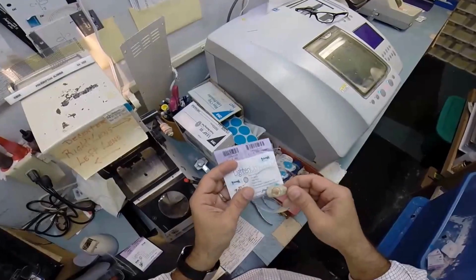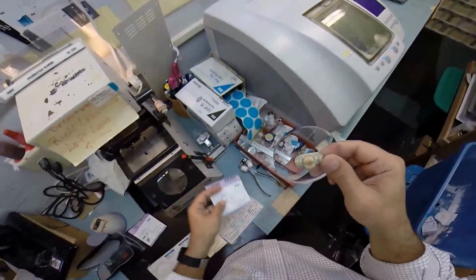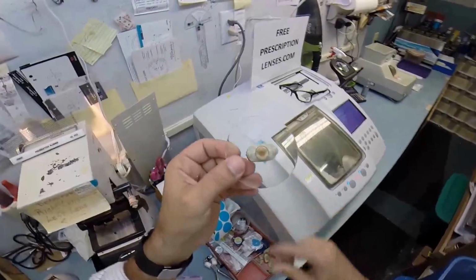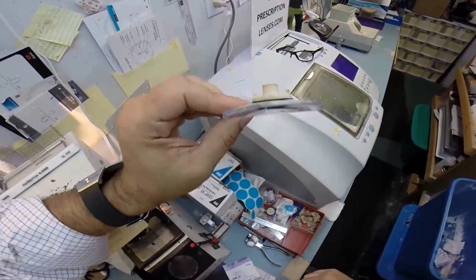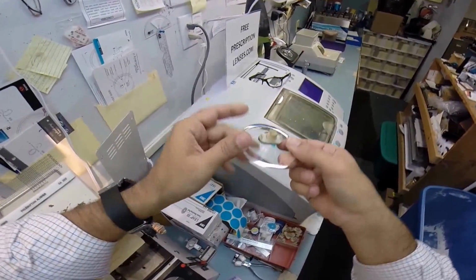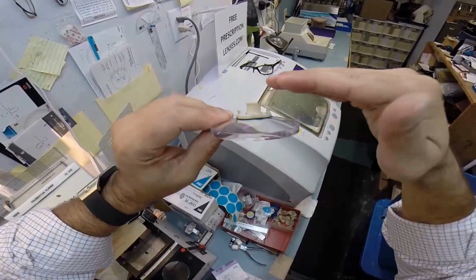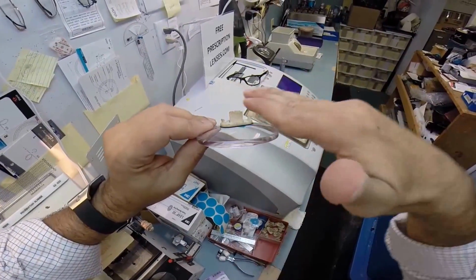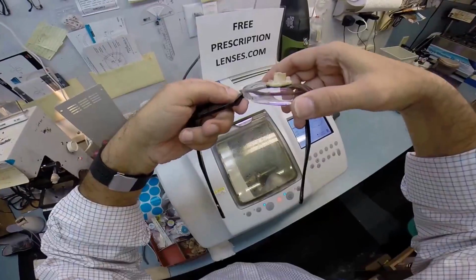This is permanent. Your lens is also aspheric, meaning not spherical. A spherical lens means completely round in every direction. It's going to give you that ugly cosmetic fishbowl appearance that you see people who buy cheap glasses. These are going to be, not only are they thinner, but the curvature itself is much flatter. It starts off round in the center and then flattens out dramatically. So that's going to give you a much better cosmetic appearance when we're done.